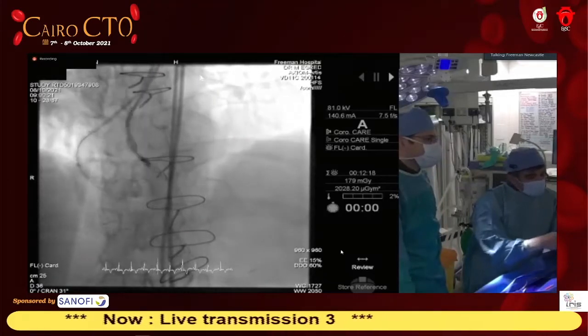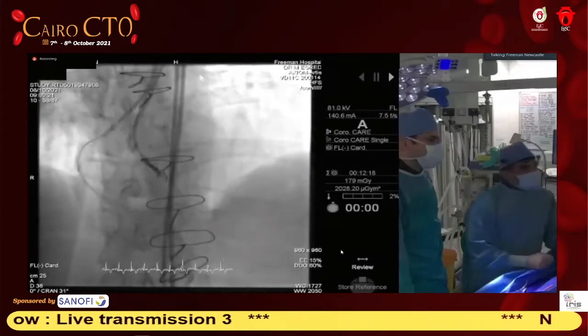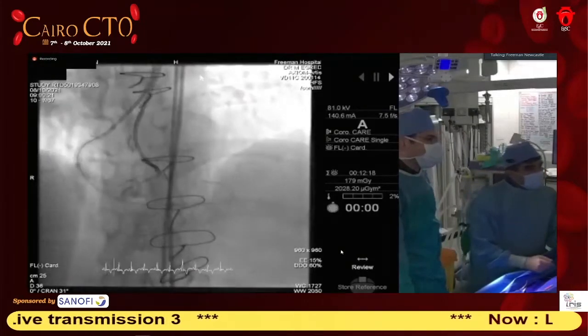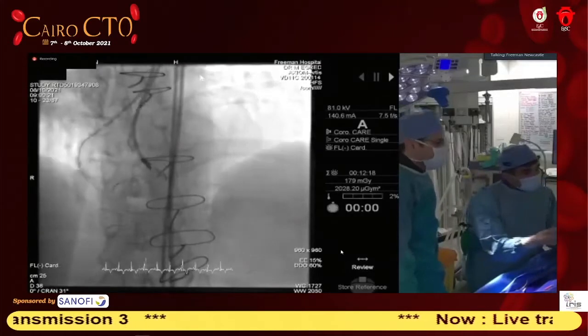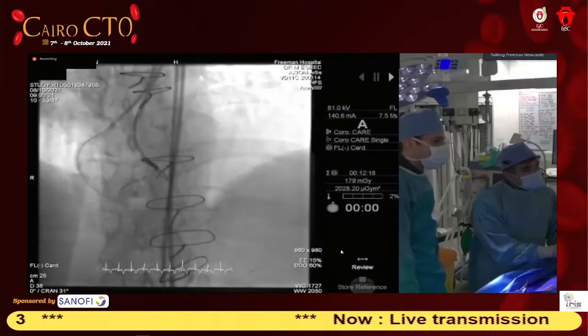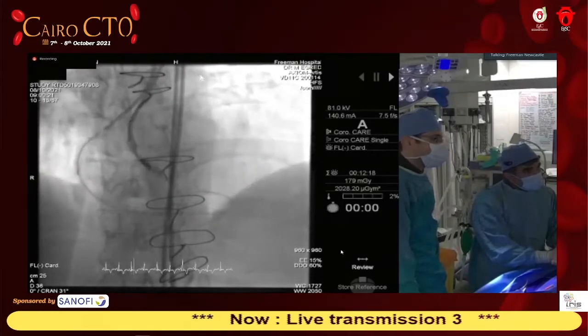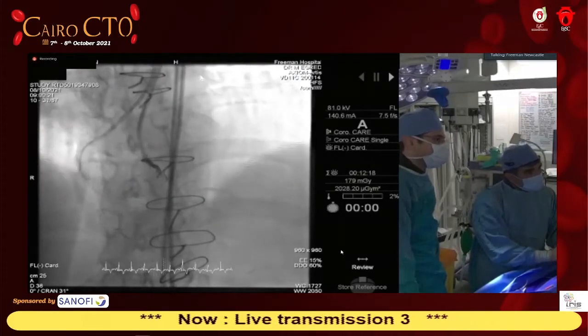With the MG, where that micro gap happens, that's where the MG will bend and the knuckle will start. And also, it's very easy. If you take your time with it, quite often you make some nice progress. As you can see here on the screen, we managed to navigate through this CTO easily.